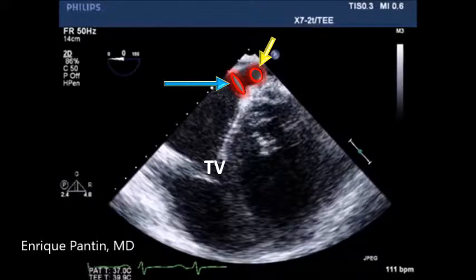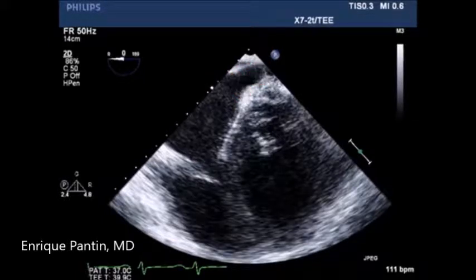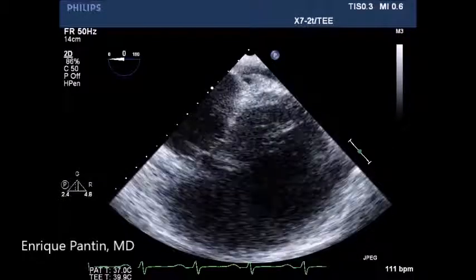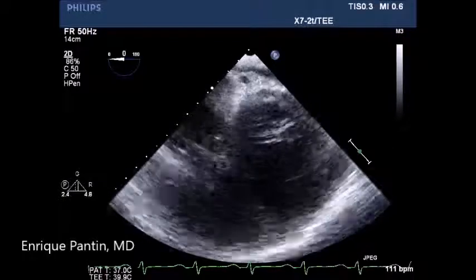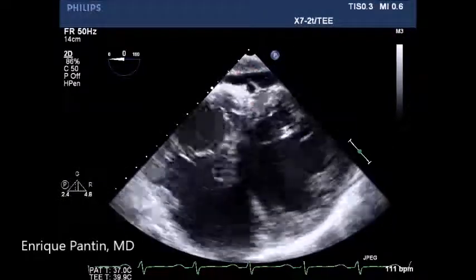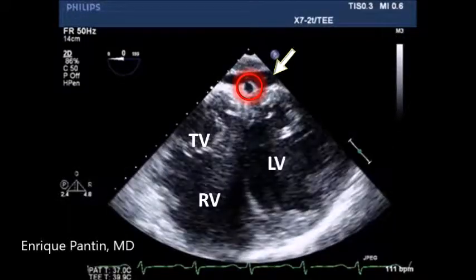As the probe is advancing to the stomach, the middle cardiac vein will develop and it will follow in the posterior interventricular groove. Note the small pericardial effusion as well.